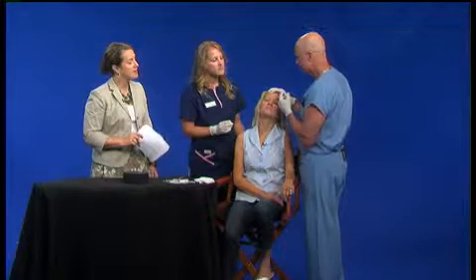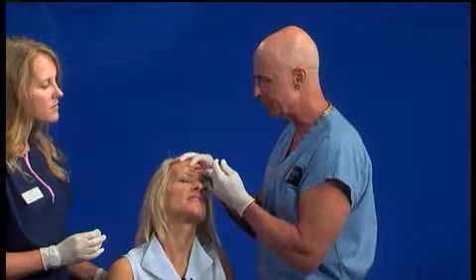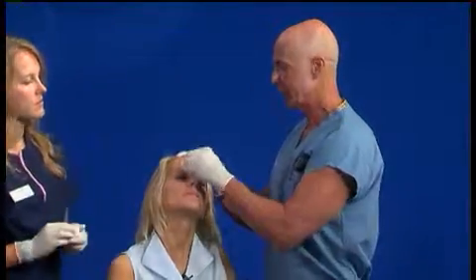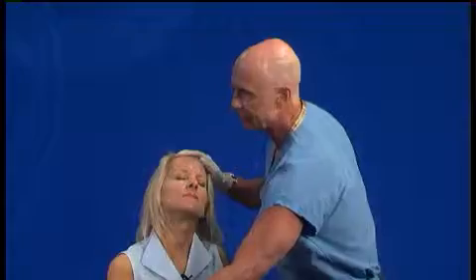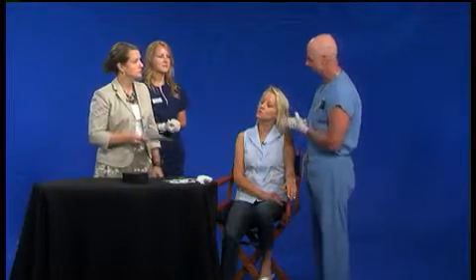Yeah, so you're relaxed, and obviously this is just an in-office treatment that can happen. Correct. I mean, as you can see, it just takes a minute. So that is a typical Botox treatment. There are also some other new brands of this. Botox, of course, was the first, and there's a product called Dysport, which is very similar, and a new product called Xeomin, which will be introduced this year as well. But Botox has remained the most popular product. So obviously we've had a little bit of a demo. You can see some of the area right there where it's been injected, but that comes down. She has these little mosquito bumps here where we've injected it, and that takes about 10 minutes to go down. And it's a lunchtime procedure, so a lot of people will come in, do this, and go back to work or back to play. So there's really no downtime or no recovery.